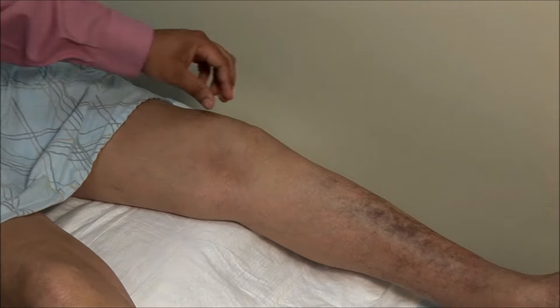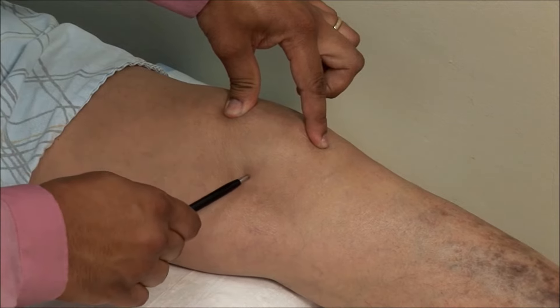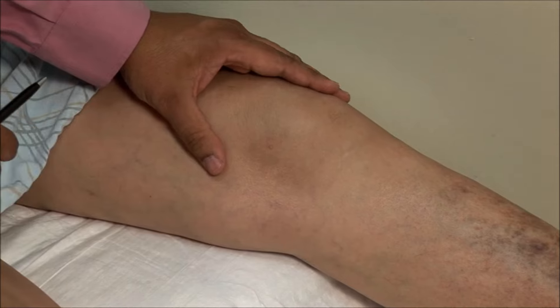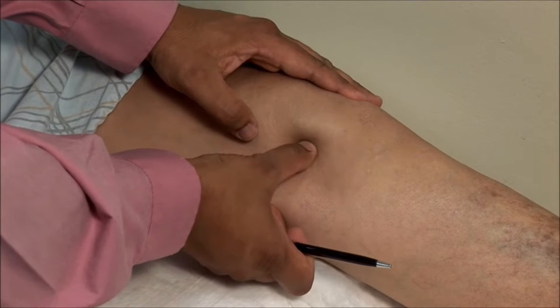Identify the superior and inferior poles of the patella. The injection point is halfway between them in the medial parapatellar groove. Tilt the patella by applying pressure on the lateral side and mark the injection point using a retractable pen in the medial space.